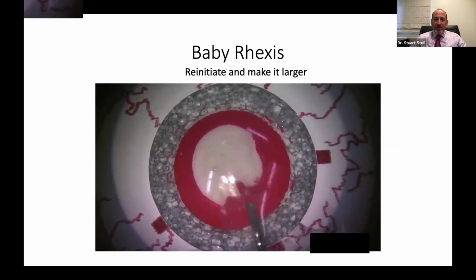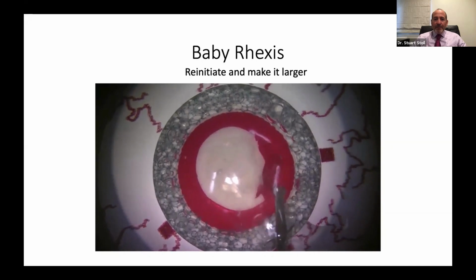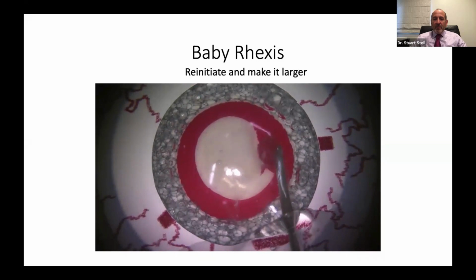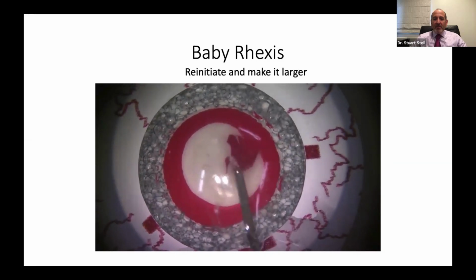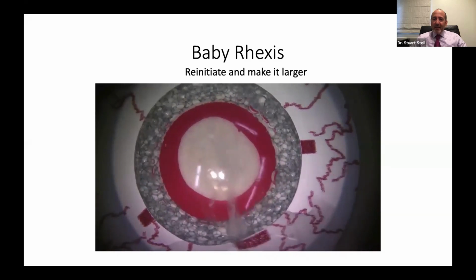So all the things that you've learned, you're using to your advantage now. You're putting everything together, and viscoelastic, fill, clear the view, grasp it. The only thing we could have done better here is finish from outside to in. You'll see a little nub at the very end. Watch, right there. So if we'd gone a little bit wider at the end, you always want to finish from outside to in to incorporate all that other stuff in there.